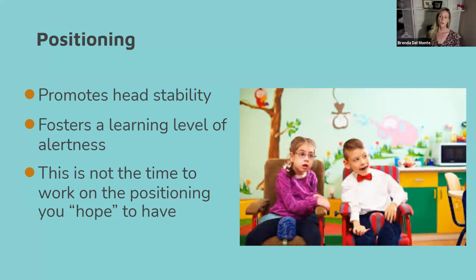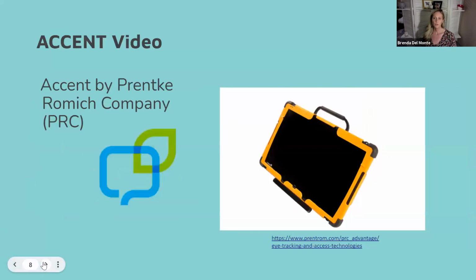So we actually work on getting kids further center with all other kinds of activities, but we mount the device where they can get it at rest, not where we want them to be, but where they actually can learn language because their body is at rest. And you might go rounds with your motor person on that, but it's the best way to learn language.